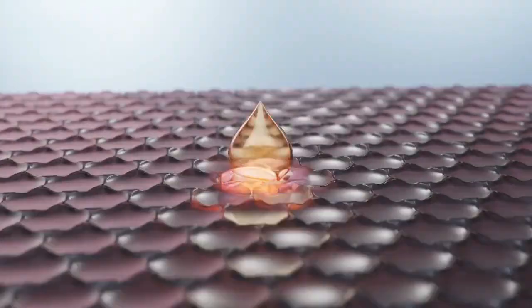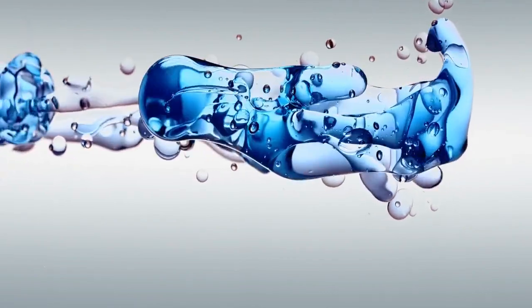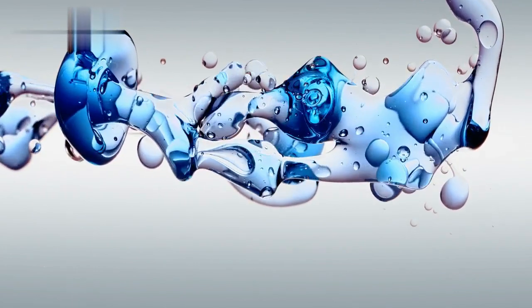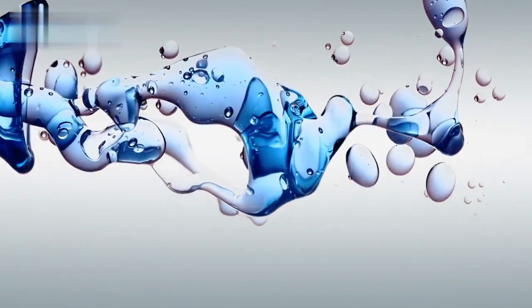Contact angle is the measurement of angle of contact between a drop of liquid and the IOL surface. The higher the contact angle, the less spread of the liquid on the IOL surface. Therefore, less chance of lens epithelial cell migration on the IOL surface.